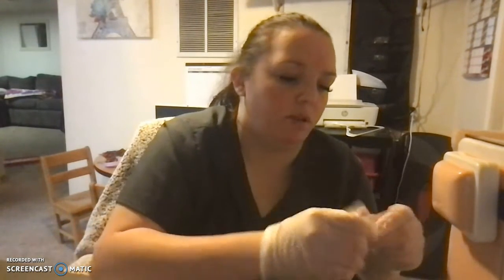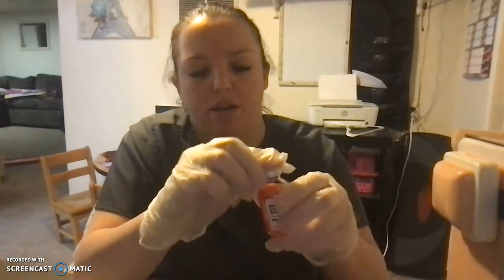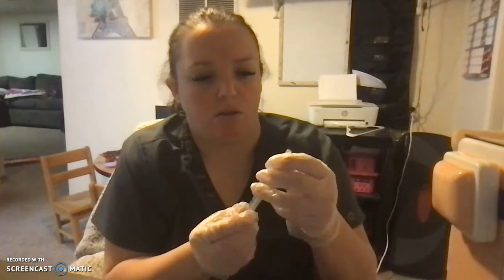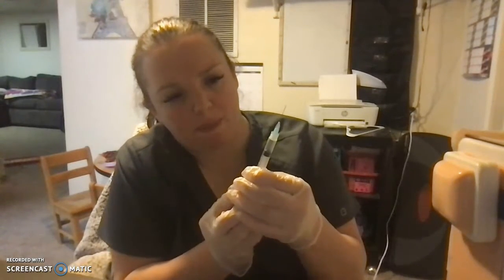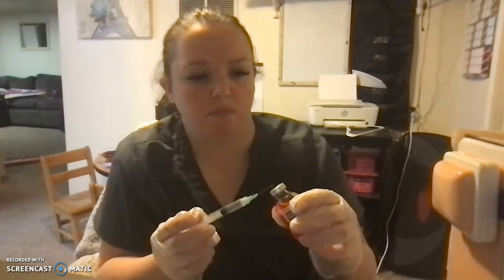Okay, so first I would clean my vial with an alcohol swab to ensure I'm not cross-contaminating or anything. And then I'm going to do 1.5 mLs. So I pull back the air there.